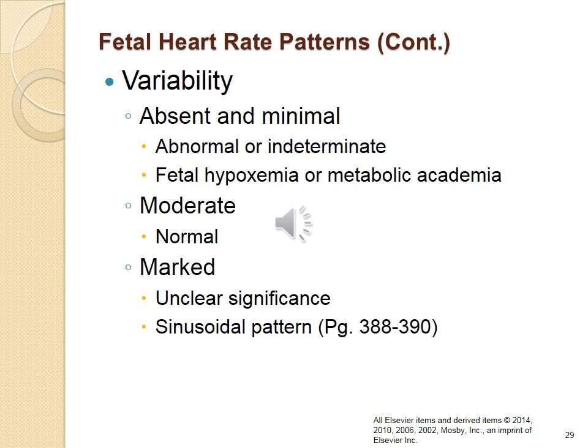Variability of the fetal heart rate can be described as irregular waves of fluctuations in the baseline fetal heart rate of 2 cycles per minute or greater. It is characteristic of the baseline fetal heart rate and does not include accelerations or decelerations of the fetal heart rate. Variability is quantified in beats per minute and is measured from the peak to the trough of a single cycle. 4 possible categories of variability have been identified: absent, minimal, moderate, and marked.